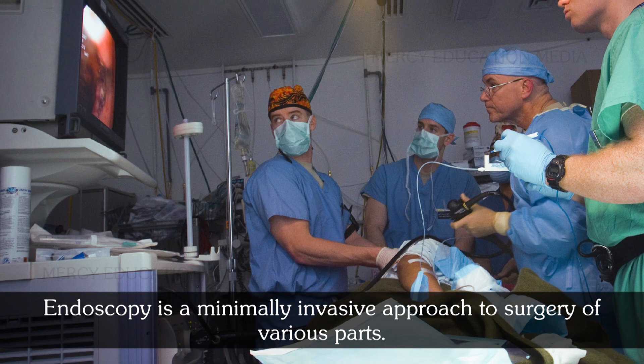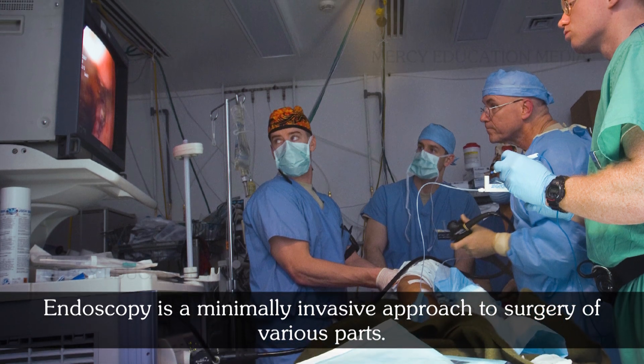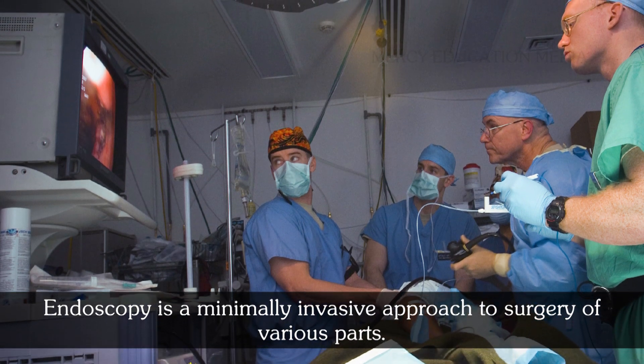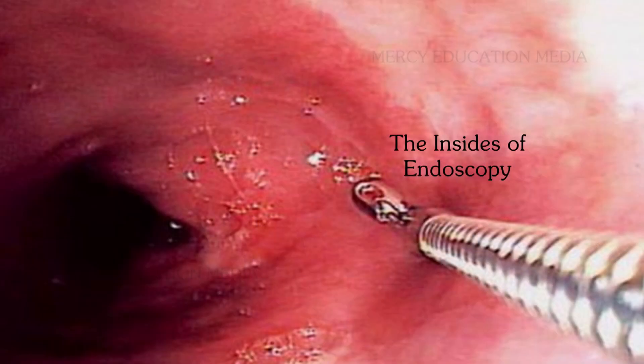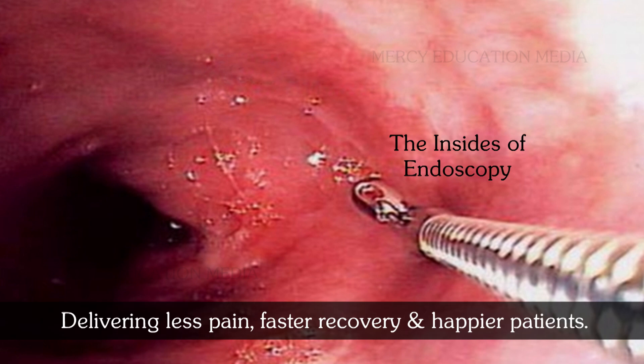Endoscopy is a minimally invasive approach to surgery of various parts. It accomplishes surgical goals while delivering less pain, faster recovery, and happier patients.